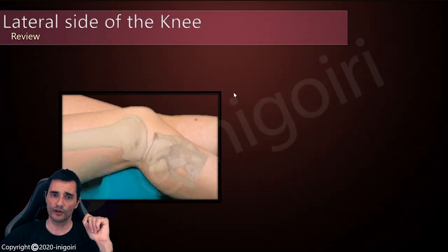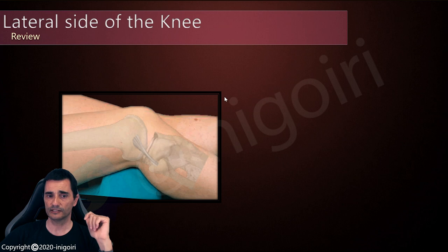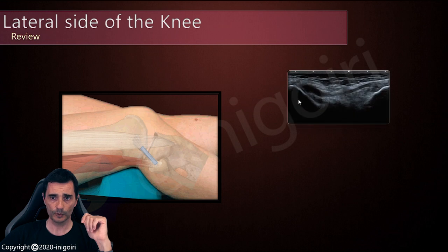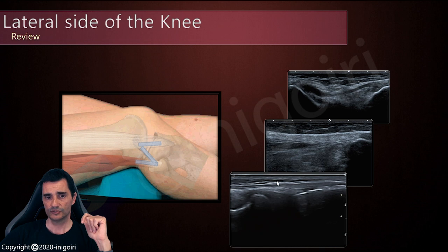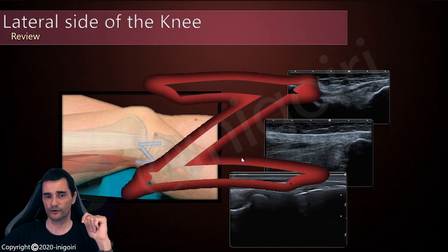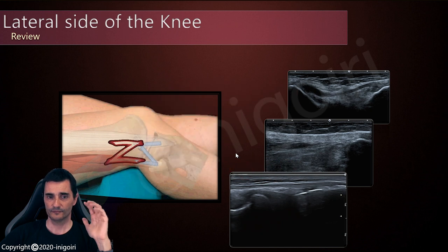A small reminder and review of the structures of the lateral side: we are going to check the lateral collateral ligament, the biceps femoris tendon, and the iliotibial band. If we place the probe slightly anteriorly from the head of the fibula, we will find this image. If we rotate the probe posteriorly, we will find the biceps femoris and the lateral collateral ligament. And finally, if we go anterior, we will find the iliotibial band. So this is the layout, more or less.